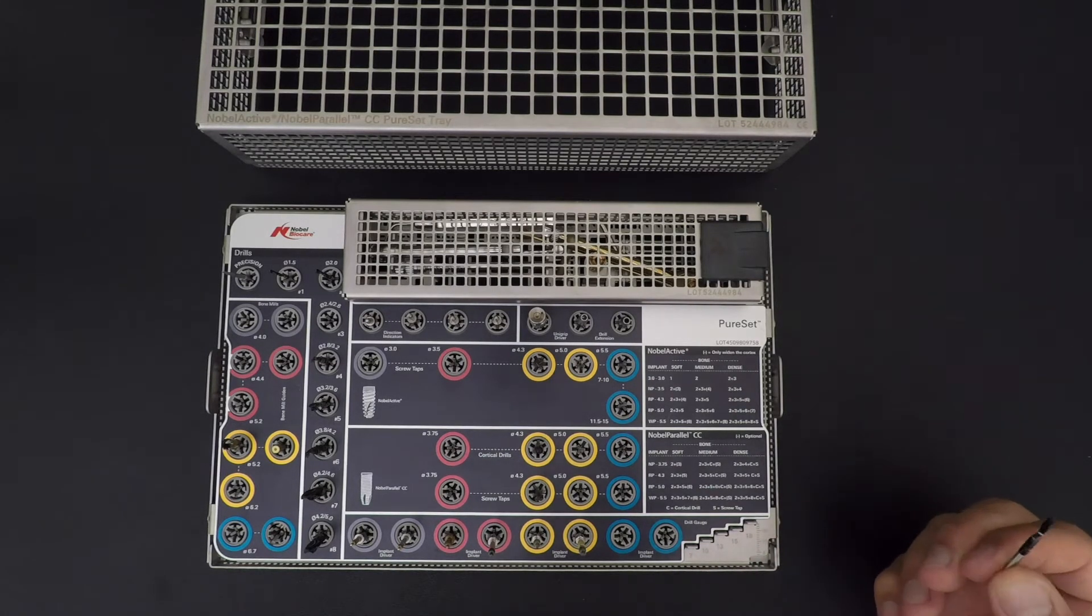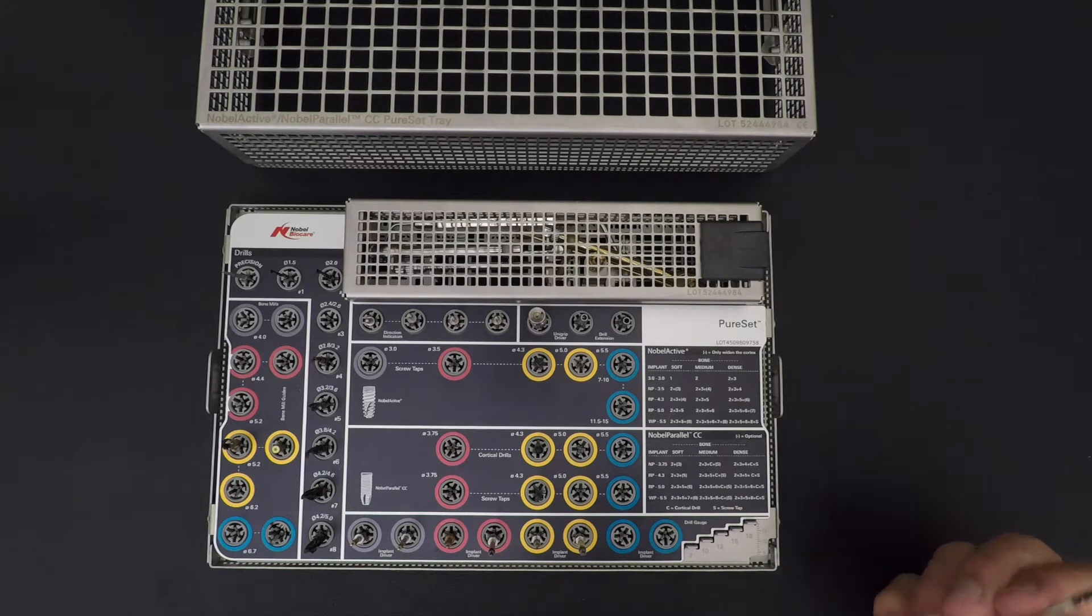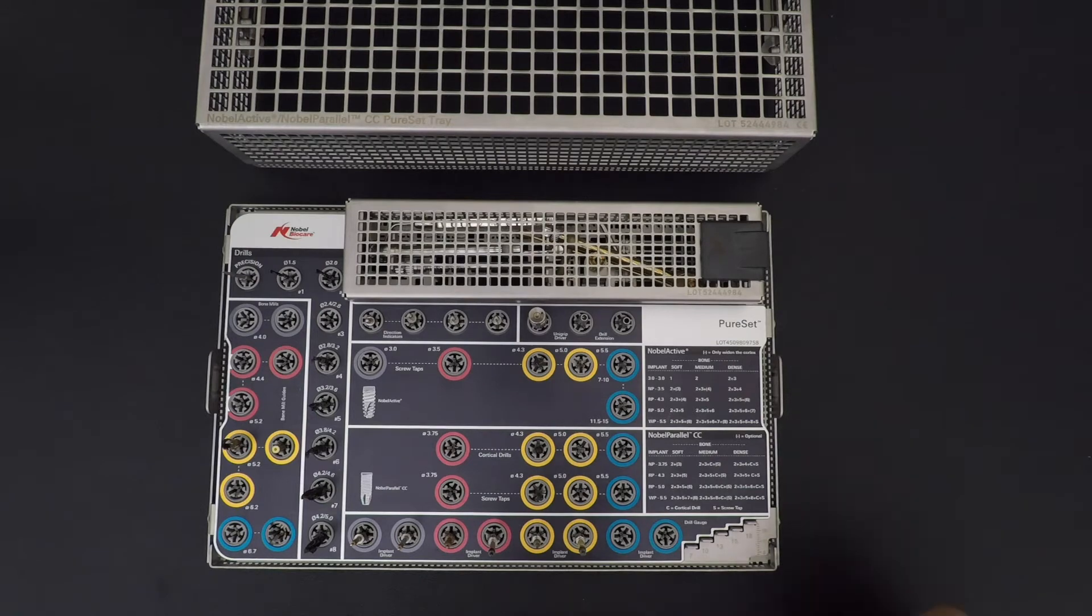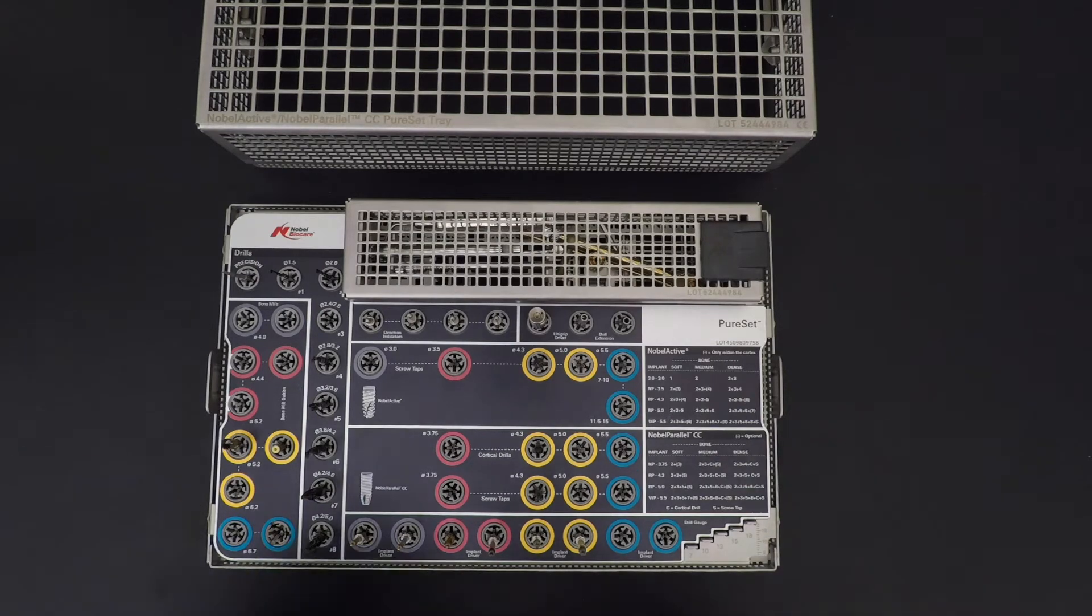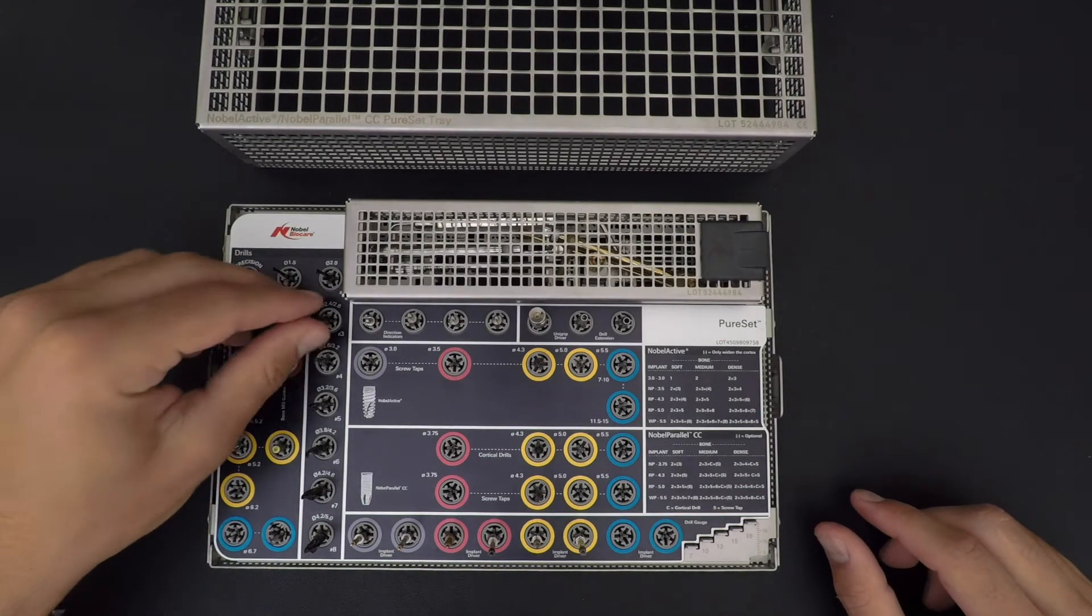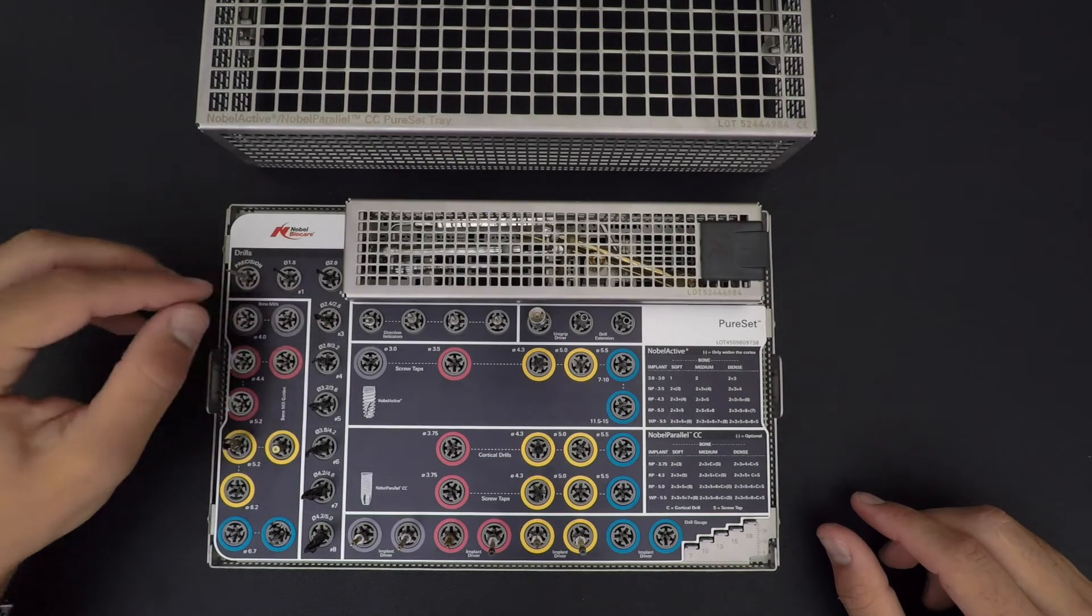That's really good to look at where you want to drill and which mark you need to go to.